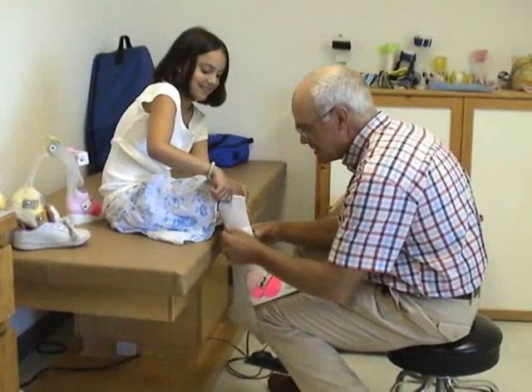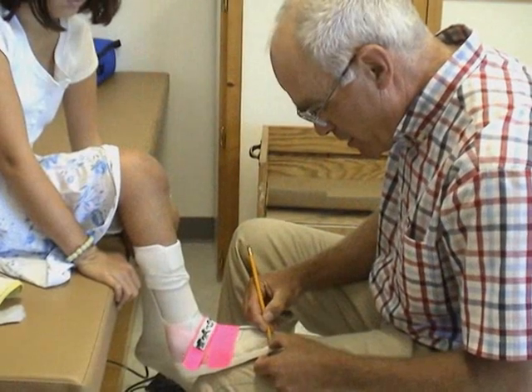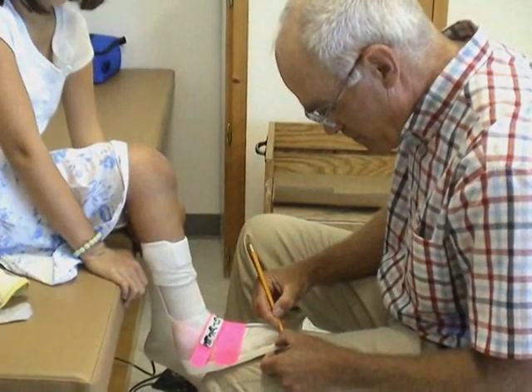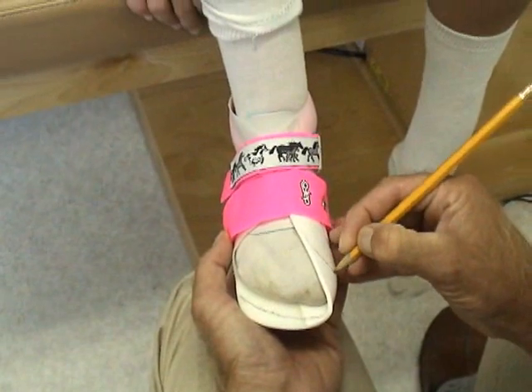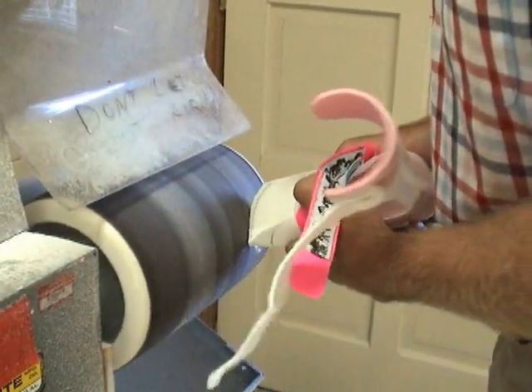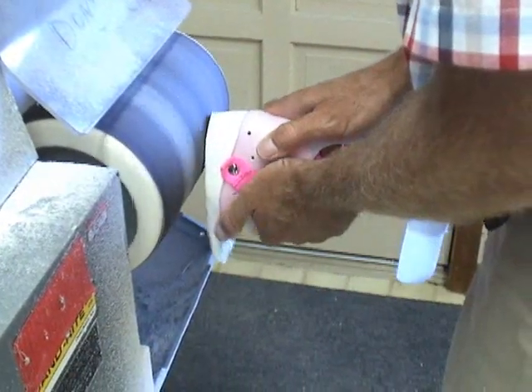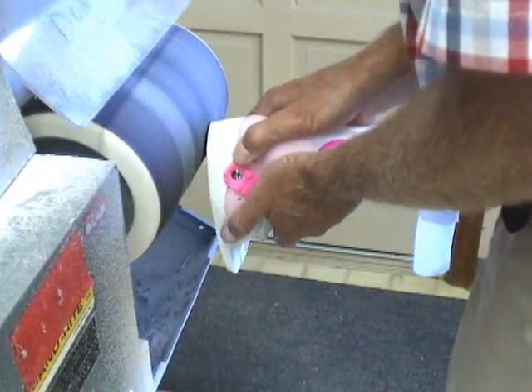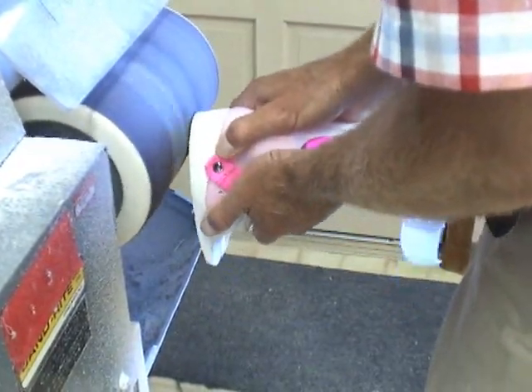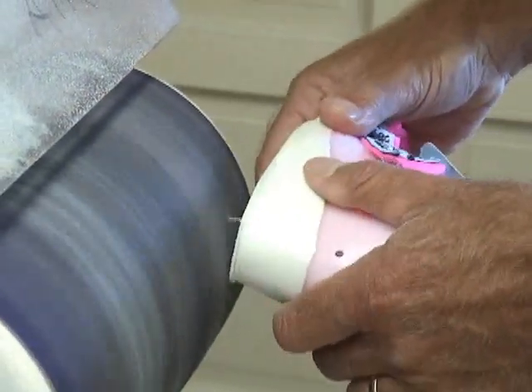Initially we're looking to see if we get a reasonably good fit, containment, and comfort. There's nearly always some initial trimming to establish the final length of the toe shelf and medial containment. It's especially convenient with Maya in that we fit her near our orthotic lab and I can use the drum sander to achieve this fitting. In this case she felt that the heel buildup was a little severe, and we took the drum sander and actually reduced the thickness slightly to soften the amount of heel pressure she felt at mid stance.